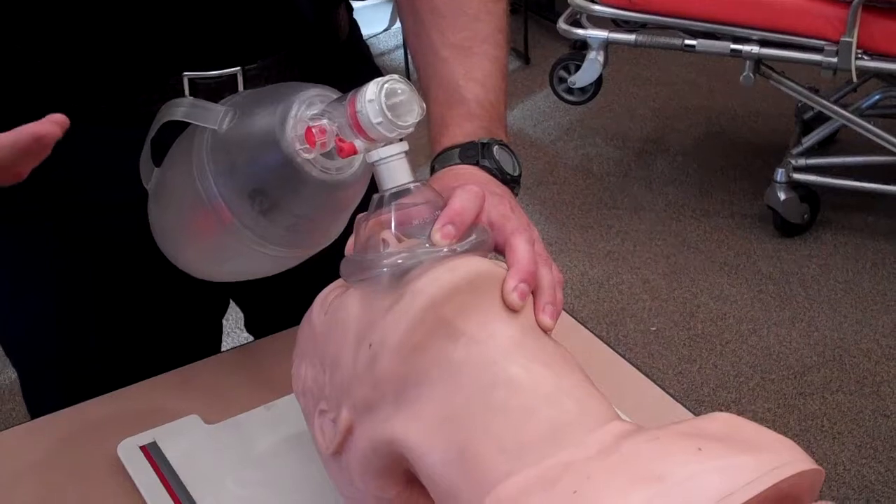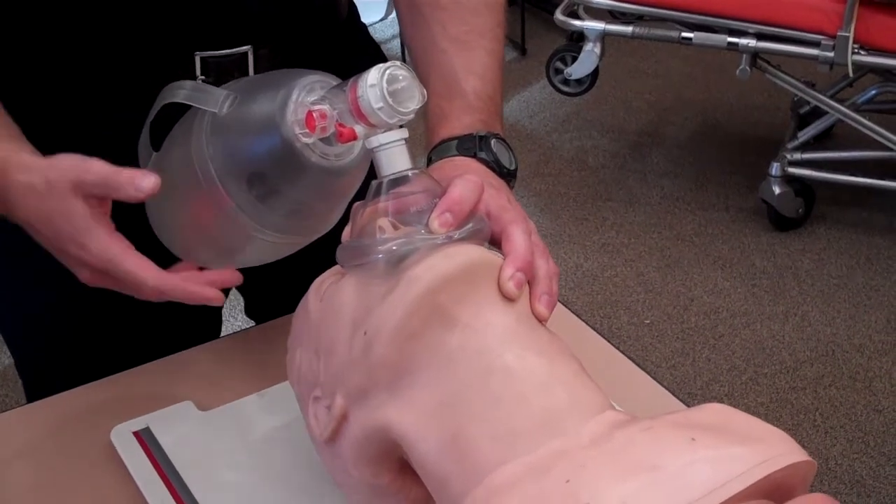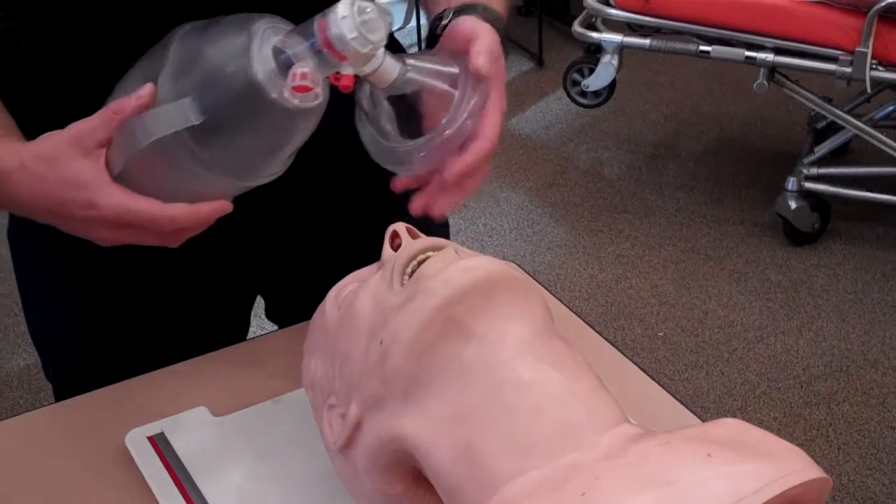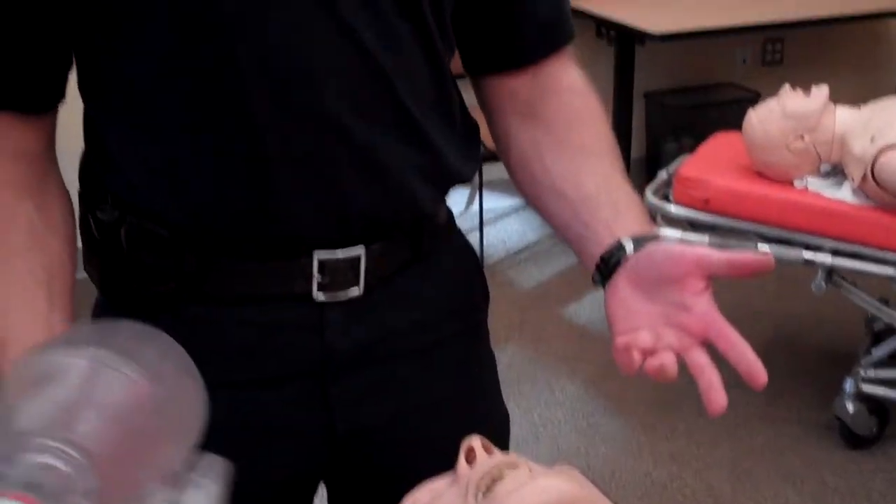This works okay in a classroom setting on a mannequin. The problem is that in a classroom setting everything's going in the ventilator's favor. You've got a rubber mannequin with no trauma — the airway's intact, so it's very easy to create a good seal. There are no mannequins with beards, and no mannequins come with COPD, CHF, or asthma. So everything is going in the student's favor.